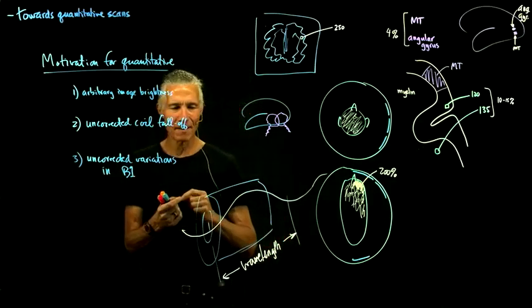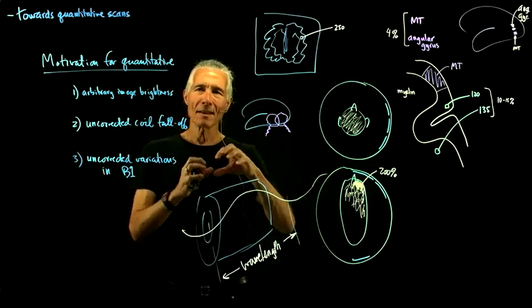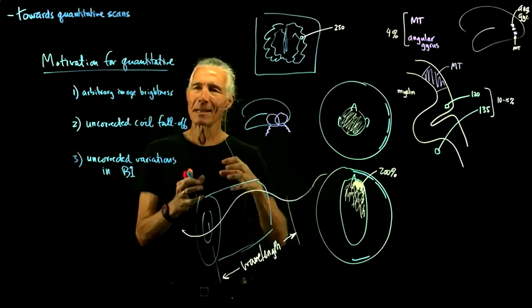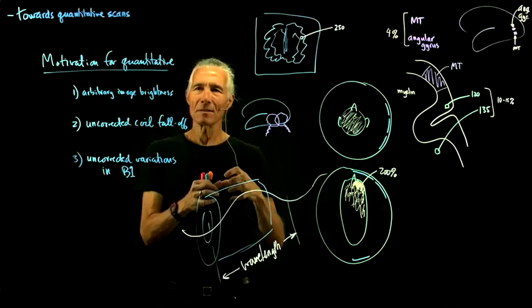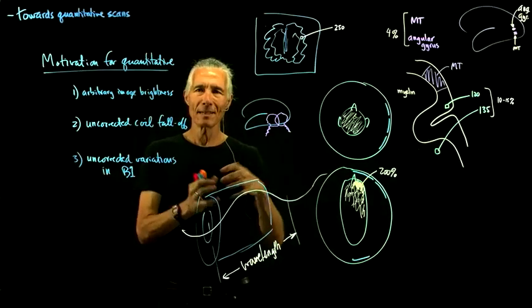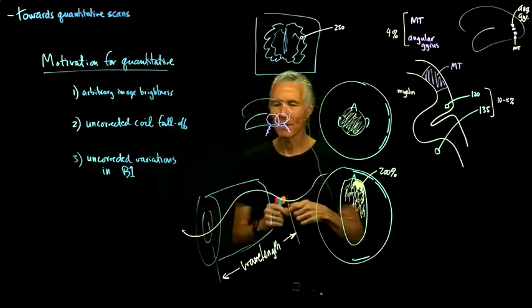And what causes that? Well, the radio waves go in, and if they're about the same size as the actual object that you're stimulating, there's going to be a tendency for them to bounce around inside the object, like a resonant cavity.